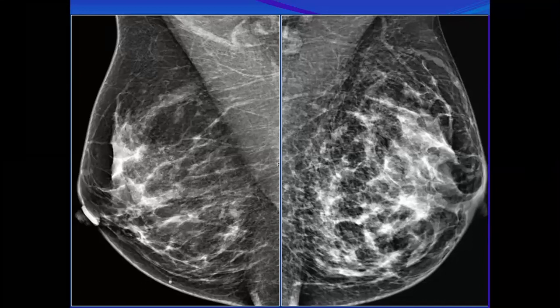So this global asymmetry is also reflecting what? Reflecting edema. What other sign in this image demonstrates breast edema? Or the edema extending to where? I can see the pectoralis major muscle has no clear outline. Excellent, well done. So the edema is extending to the prepectoral regions.